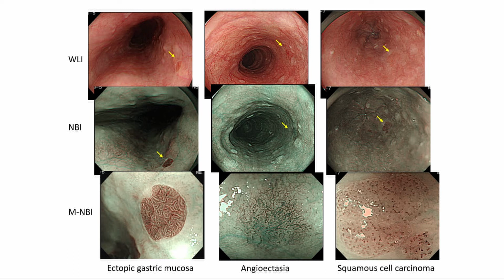Okay. Why do you, Rakesh, now what's your name? Rajesh. Rajesh, why do you call this a squamous cell cancer? Why do you call it a squamous cell cancer here? Are you able to make out? Can we switch this off? I'll use this. No, let this be. They can switch it off there, that's all. Anyone?